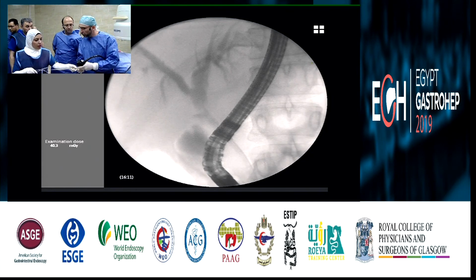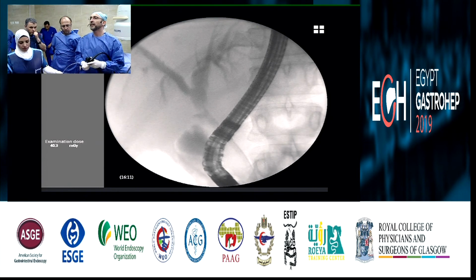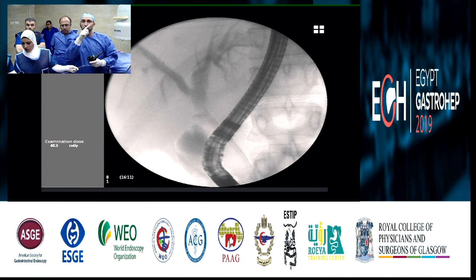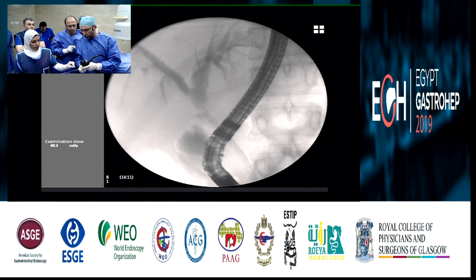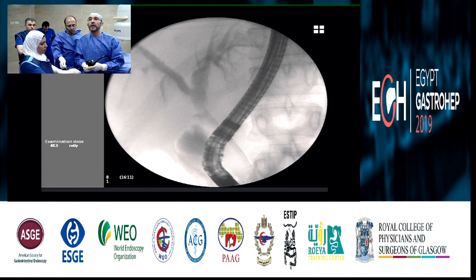I will always start from the left, because anatomically the left is always more angulated and the right is more straight. Now you see here the ducts are pretty straight in this patient. So we always start from the left. But why are we not inserting the stent in the right system now? This is only for protection now.